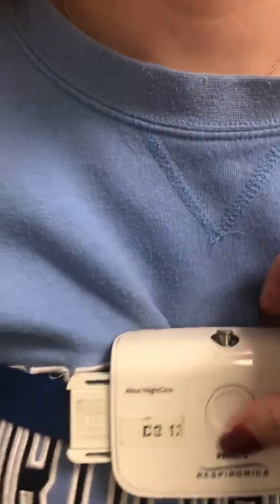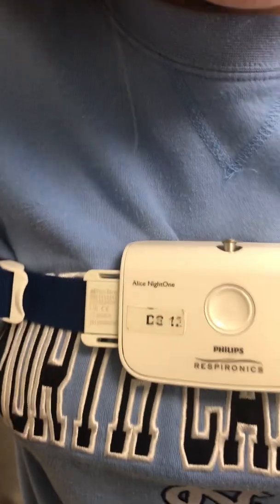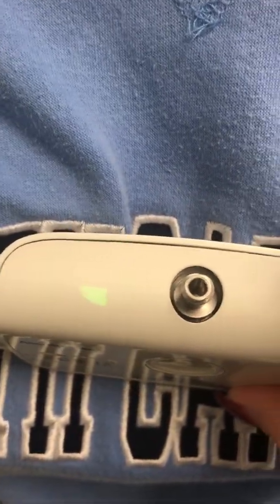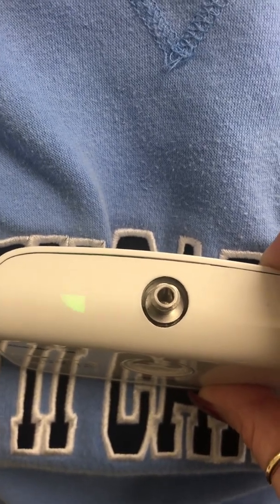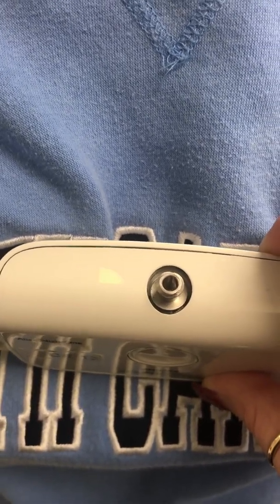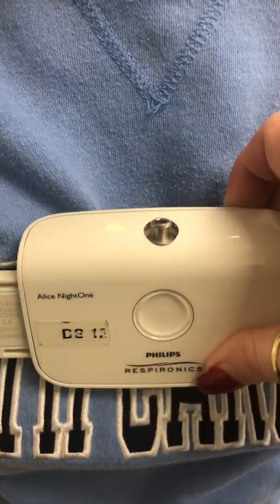You will also notice once the device is in that you will see a pie chart spinning. This lets you know the device is active and beginning to work. Let's continue placing the items on.